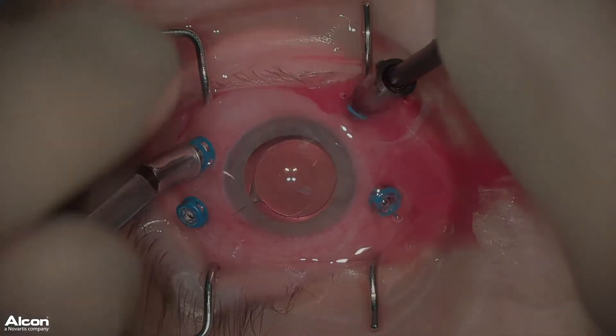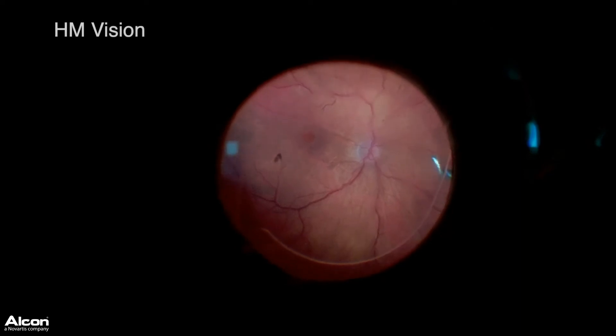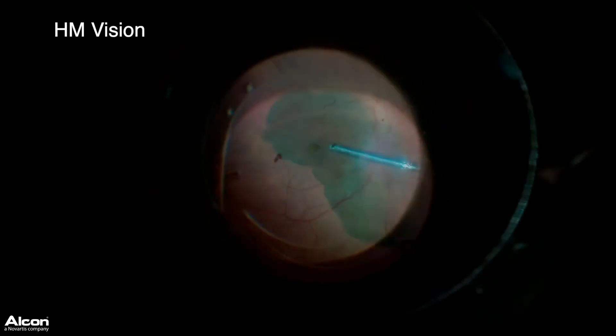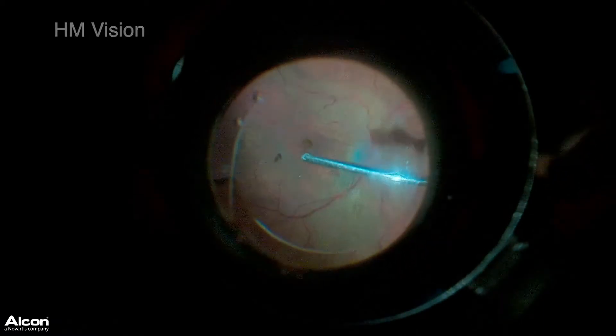This is a patient who had failed standard macular hole surgery and an internal limiting membrane flap surgery, so we're left with very few options outside of an autologous retinal transplant.